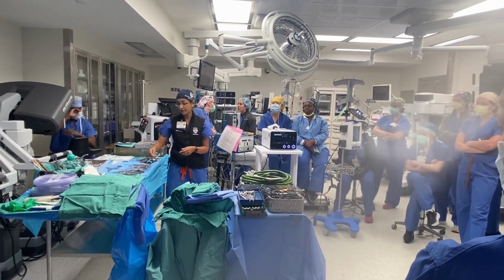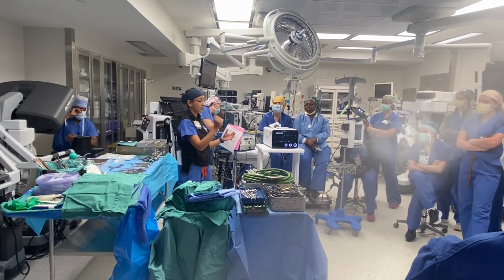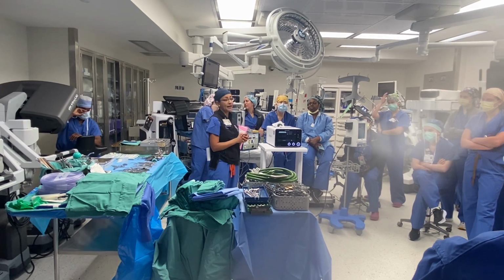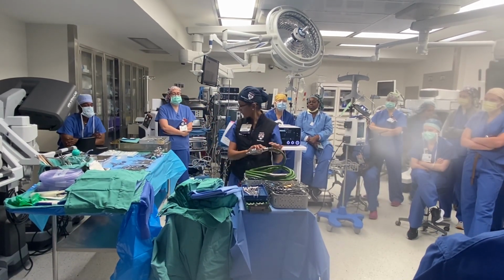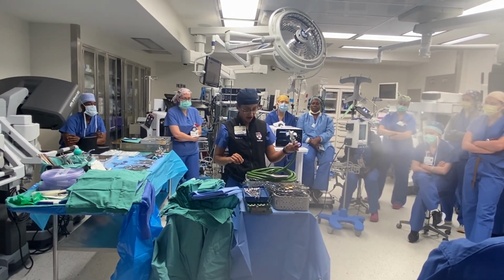Okay, so next we're down to the head, right? The whole point of being in there is we got to get that pressure out of the head. So that involves obviously drilling the skull. So Melissa, you might need to help me out here.